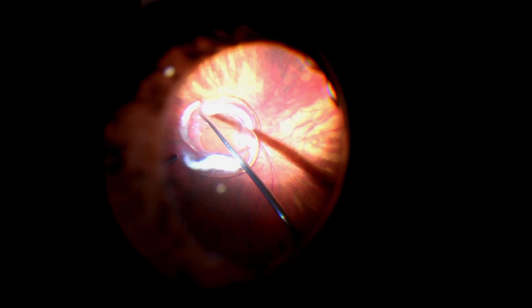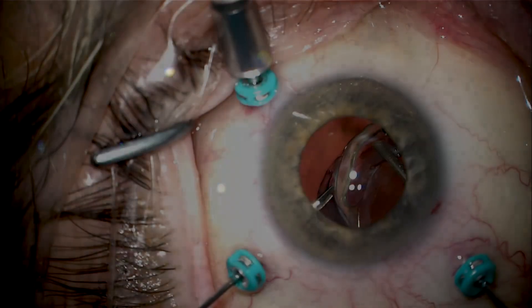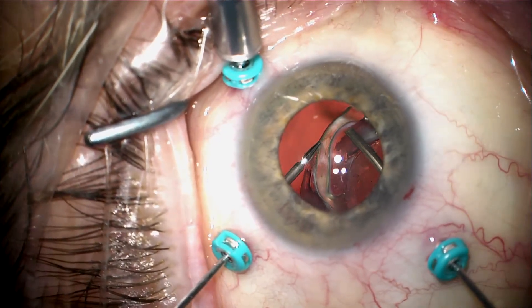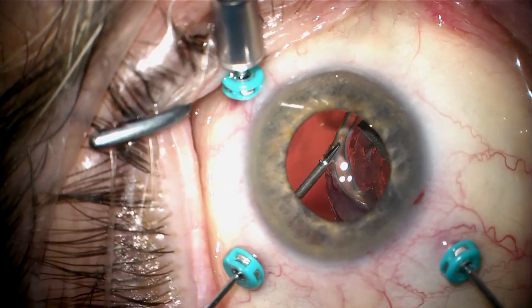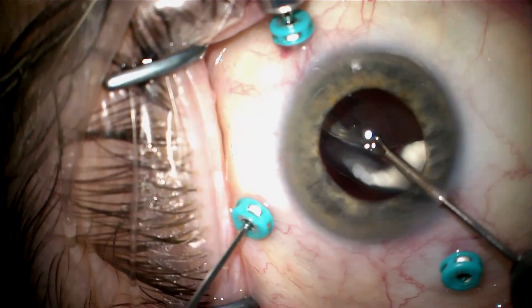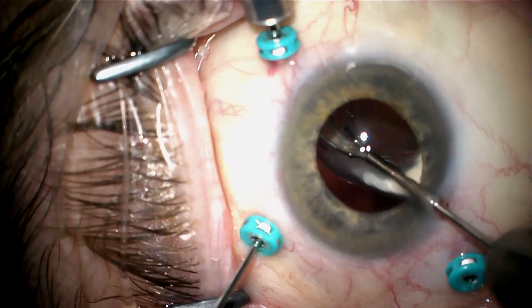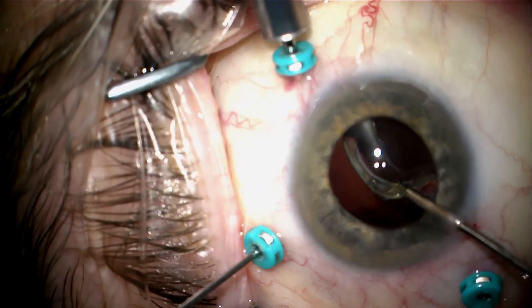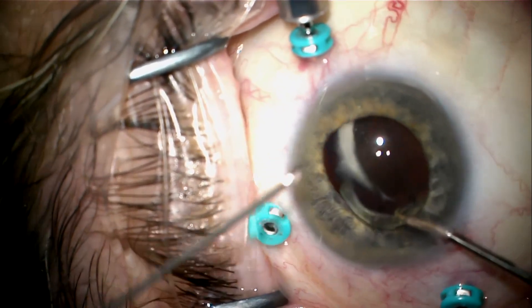Here's the lens-bag complex sitting on the retina. I'm going to aspirate that with my 25-gauge vitrector, keeping the vacuum on full when I switch to an anterior view. I'll go through the pars plana with the maxi-grip forceps and grab the haptic of the lens securely. I'll then hand the lens to micro-forceps coming through the paracentesis to bring it forward.